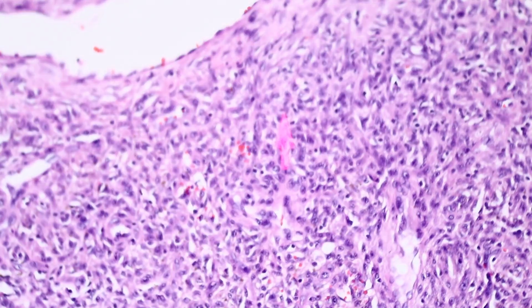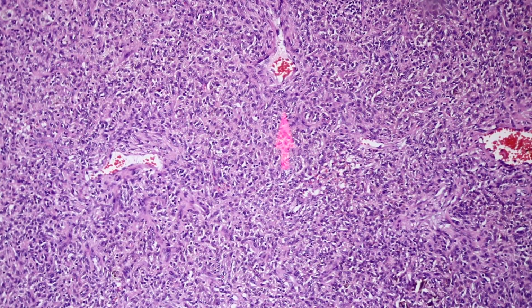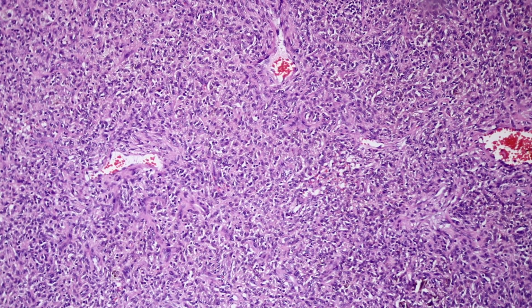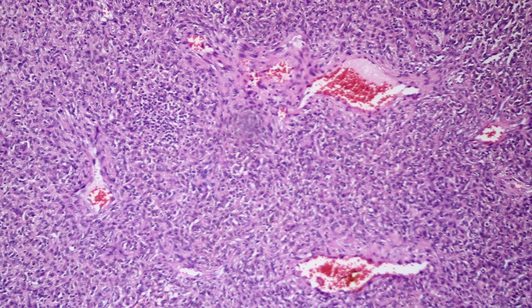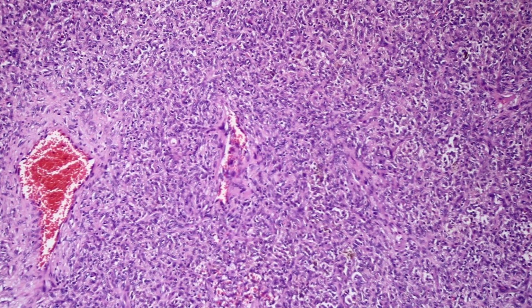And you could argue that it is hypercellular. Some people might call this a cellular dermatofibroma. I tend to use the term cellular dermatofibroma for lesions that have a very prominent fascicular pattern. But either way, it doesn't matter, because the point is both cellular and aneurysmal forms of dermatofibroma tend to be large, and they tend to go deep into the dermis, sometimes even the subcutis.